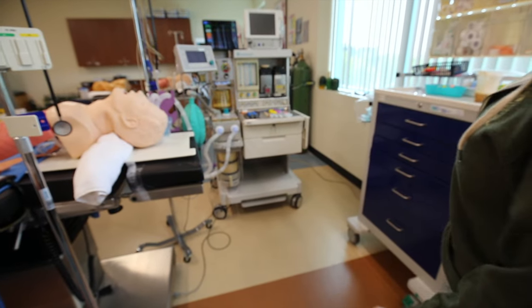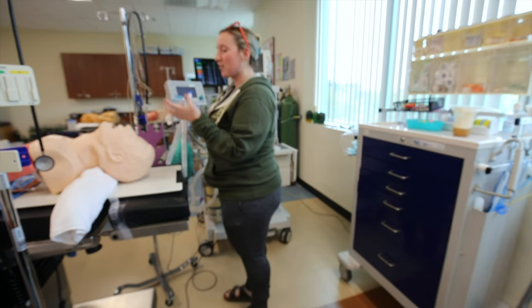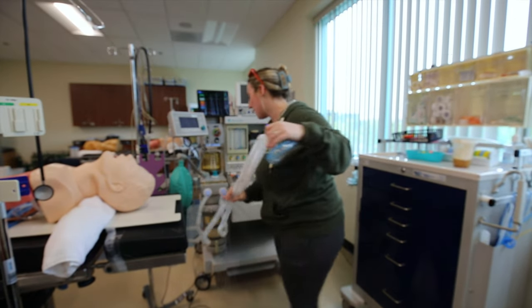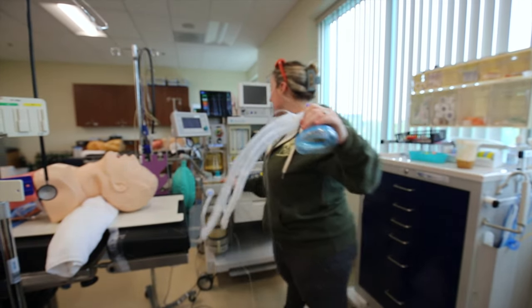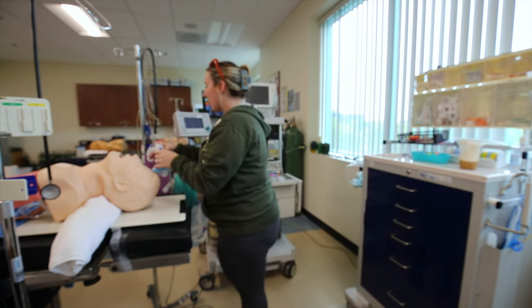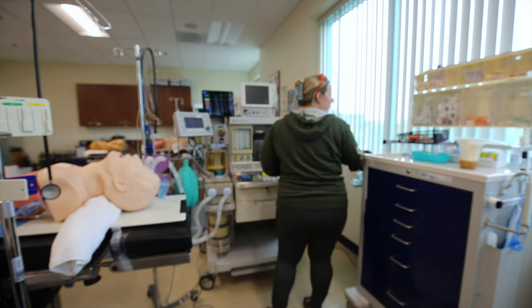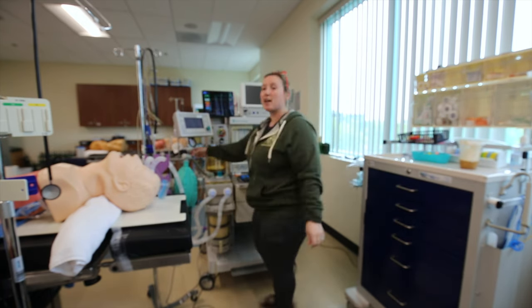Starting from the top, I'm coming in. I'm making sure that I have my mask, I have my breathing circuit, it's connected with two filters. My end-tidal is on and it's also connected. I have a reservoir bag right here. I have an Ambu bag with a mask.